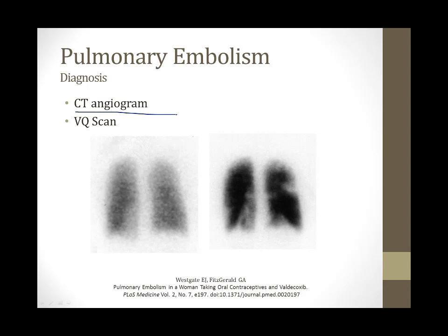There's another test that is sometimes used called a VQ scan. This is a nuclear medicine test. The patient inhales a gas with a nuclear tracer in it, and this shows you which portions of the lung are being ventilated.